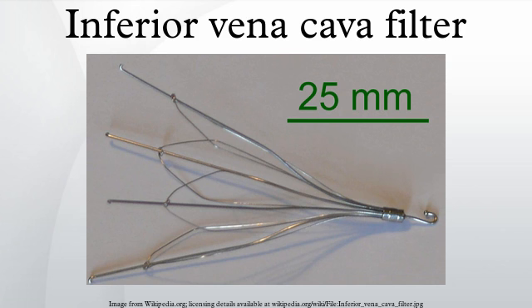These hooks aid in the anchoring and healing process, as they allow the tissues to engrow around them, securing the IVC in place. It is unlikely, then, after 4 to 6 weeks of healing, that an MRI of 1.5 Tesla, up to 3 Tesla, will cause any level of dislodging to occur for the IVC filter.